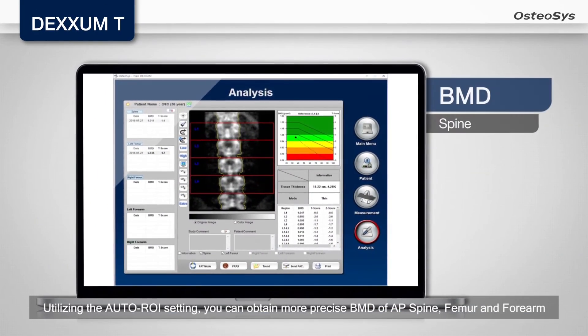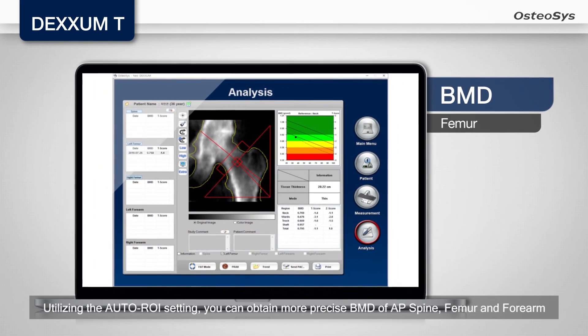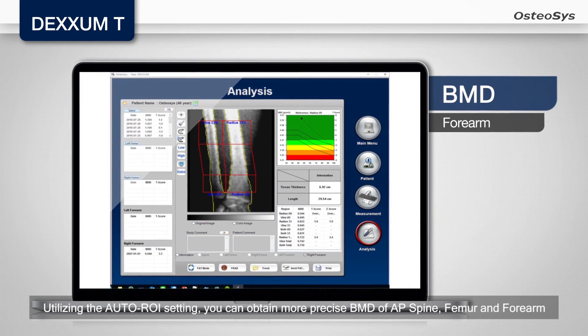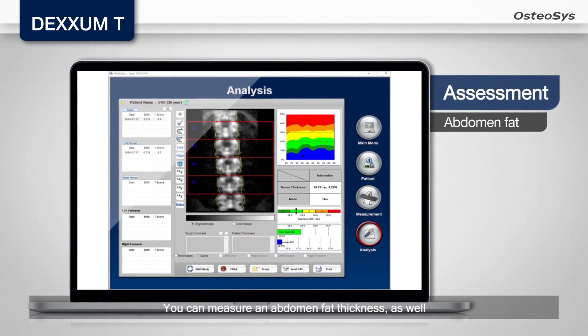Utilizing the auto-ROI setting, you can obtain more precise BMD of AP spine, femur, and forearm. You can also measure abdomen fat thickness.